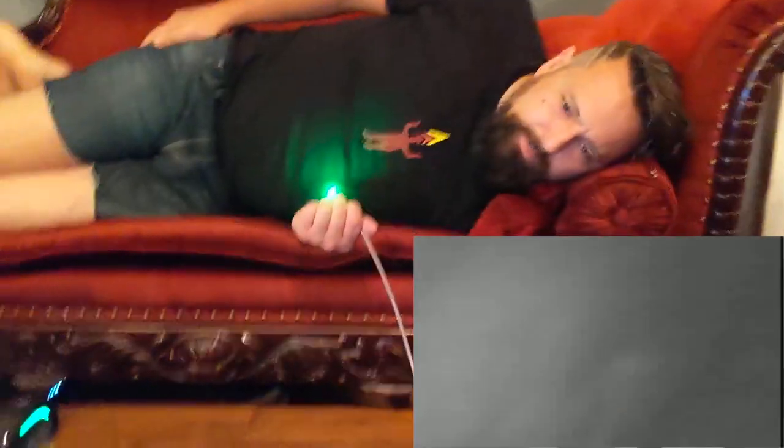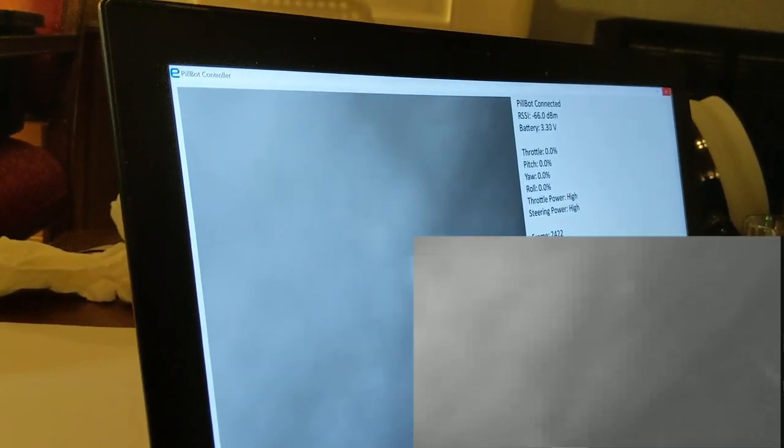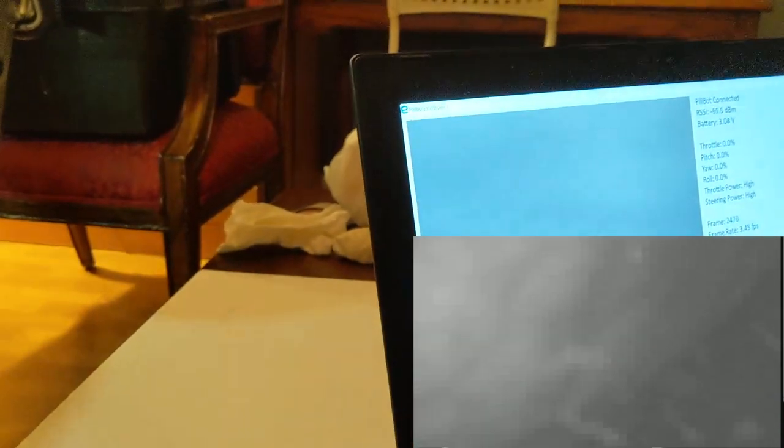So take a look here at this James. You can see sort of some of the features of the surface. Is that the pyloric sphincter? No, he's on the wrong side. If he flips over on the other side you might see it. I'm going to go a little bit to the right. If I stand upright you'll probably have a look at the pyloric sphincter. I'm going to back up a little bit. But the cool thing is you're actually moving around independent of me. Like I'm just sitting here.